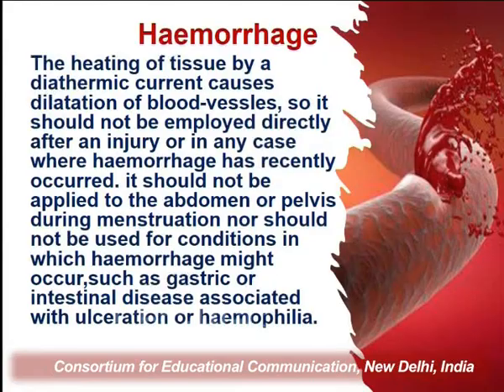Now, contraindications of short wave diathermy. So, first one is hemorrhage. The heating of tissue by the diathermic current causes dilation of blood vessels. So, it should not be employed directly after an injury or in any case where hemorrhage has recently occurred.